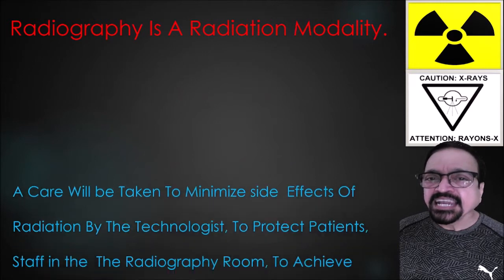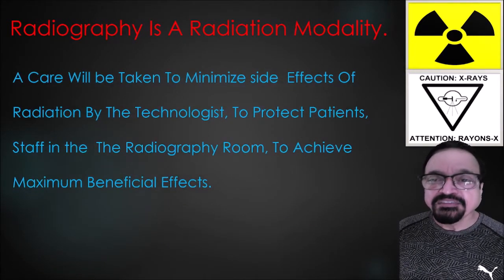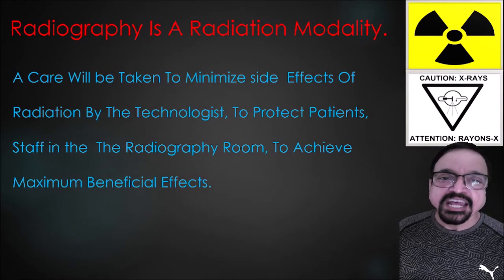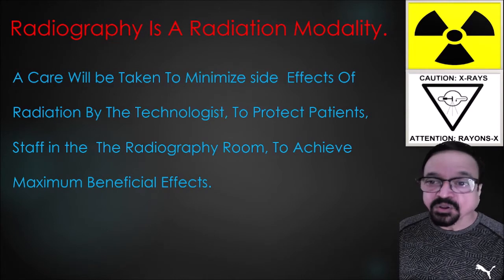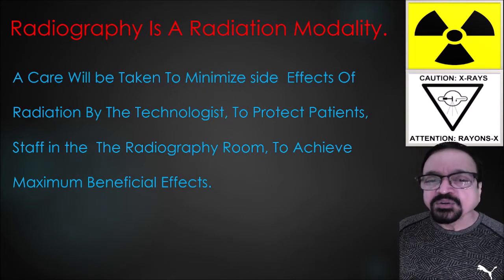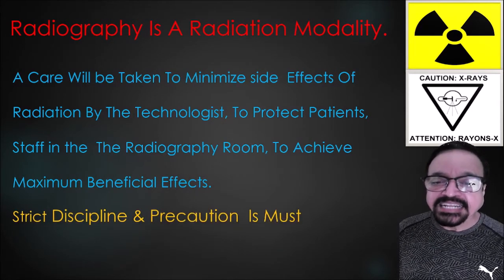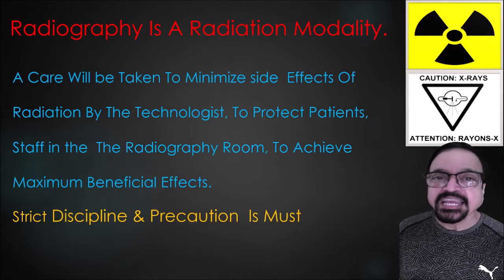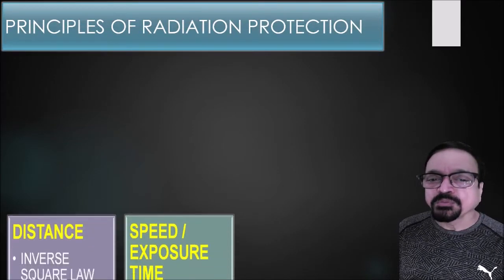Mind well, it's a radiation modality, and radiation has effects as well as side effects. Care will be taken by technologists to minimize side effects of radiation, to protect the patient and staff in the radiography room, to achieve maximum benefits with minimal side effects. A strict discipline and precaution is a must. Everybody should follow discipline, and whatever the technologist is telling has to be followed properly.